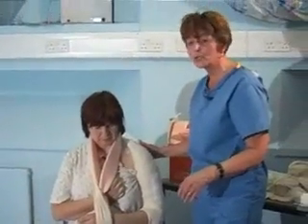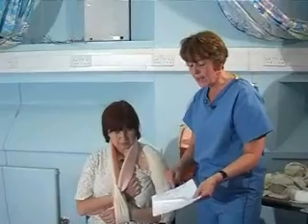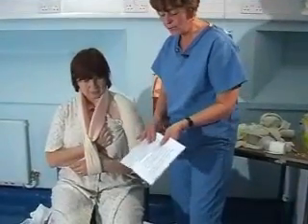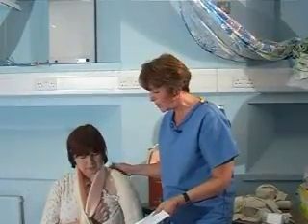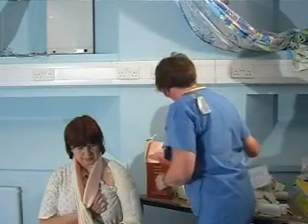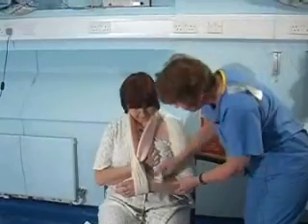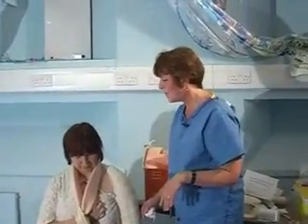That is the end of the U-slab. Clean the patient up, and always give plaster instructions — these are very important. Get the patient to sign at the bottom confirming that plaster instructions have been given. One part goes to the patient and one part goes in the notes with a signature saying she fully understands the plaster instructions. I'm telling her: if she gets it wet, if she has any pins and needles, any circulation problems, especially if she finds any problem with moving the wrist, she should come back — and the contact number is on there. Always make sure the patient can move their wrist. Also importantly, this patient has a ring on, and that ring should have come off before she even went to x-ray.